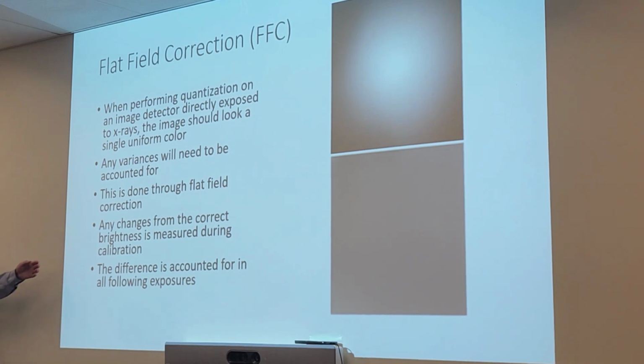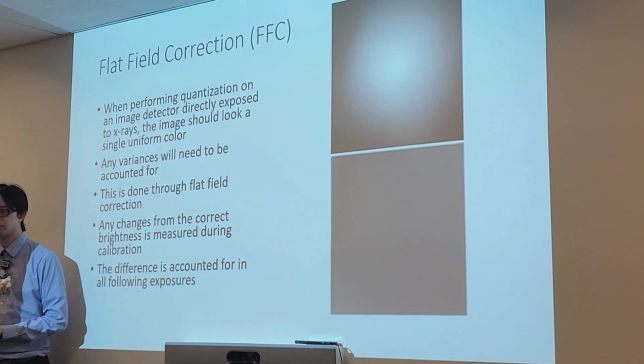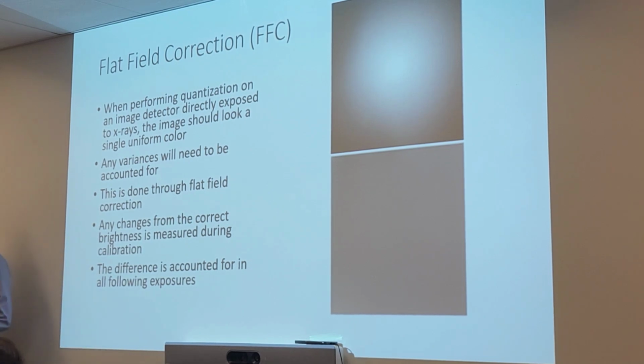So any questions about this one, flat field correction? Yes? You said it remembers the parts that are off and adjusts the brightness, or what is it? Or the anatomy? What does it adjust? Right, so it adjusts the brightness, it adjusts those pixel values.